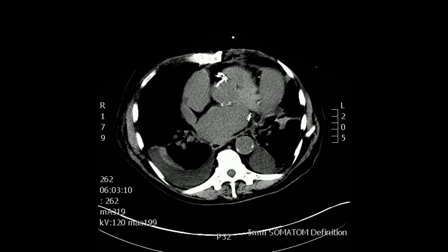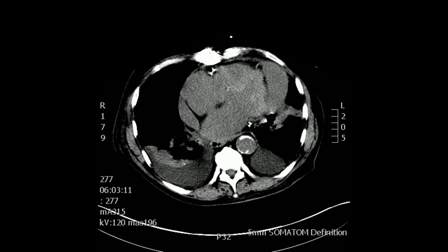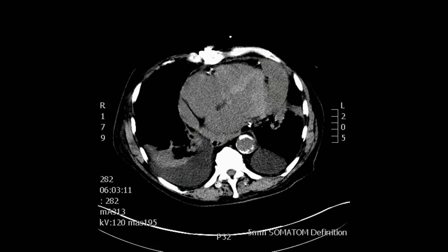As you continue to move distally, we see a pericardial effusion in purple, and a posterior portion of the heart and anterior portion in green, the pleural effusions, and some lung atelectasis on the right side.